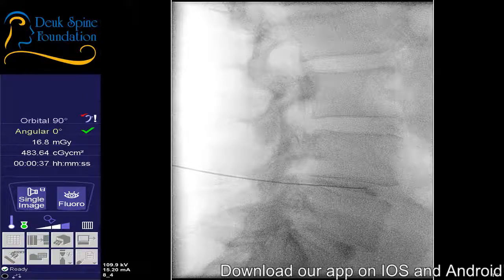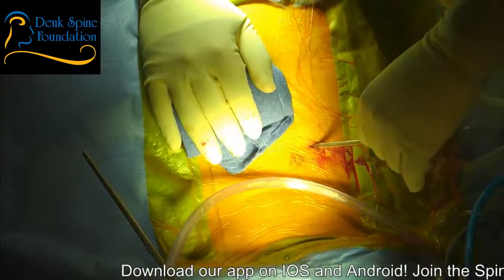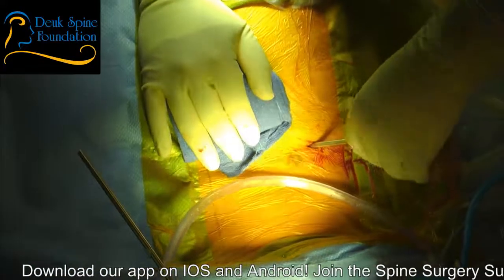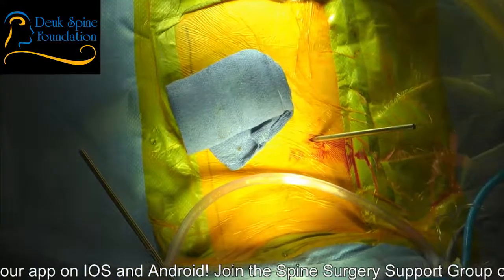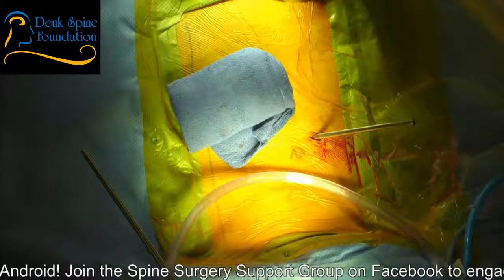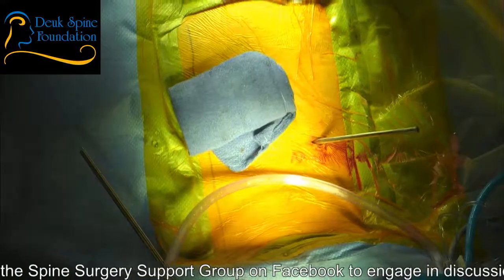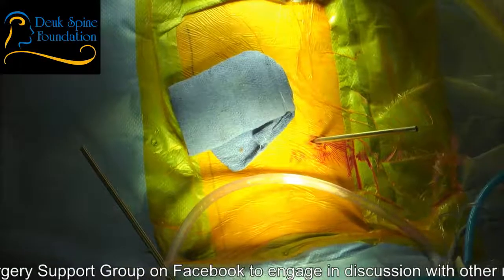Shot. That disc is the L45. Show me the bottom, the sacrum a little bit. I think you're a little higher than I want you to be. Just a tiny bit. Shot. Looks good. There's that pseudo disc. Perfect. I like it. All right, now we can advance the dilator, as long as our anesthesiologist gives us the green light, thumbs up.